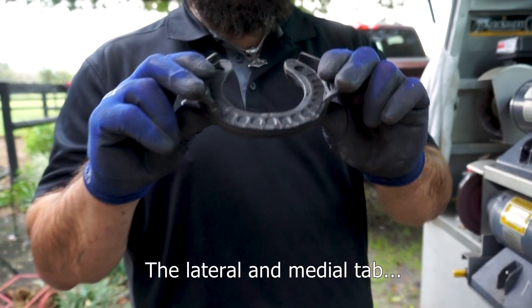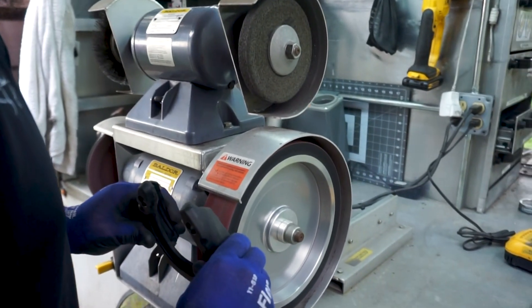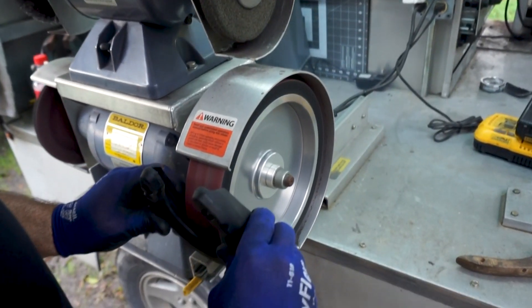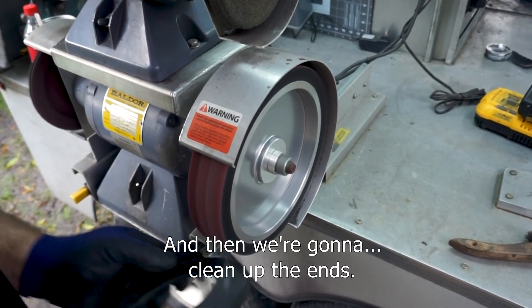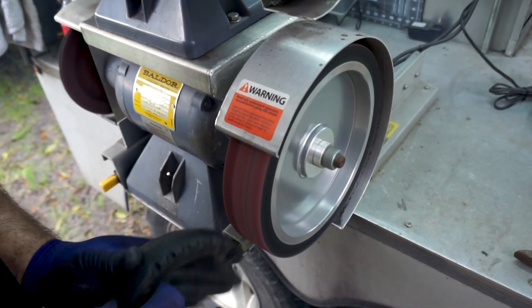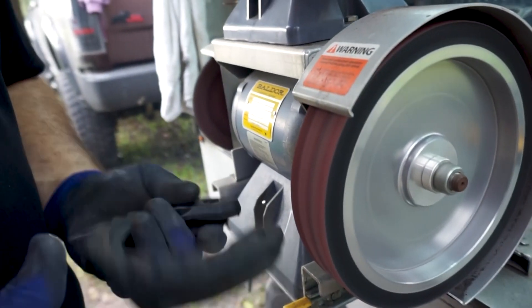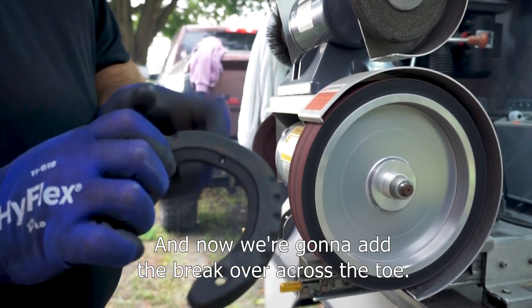Now we're going to bring it to the grinder. We're going to move the lateral and medial tabs out to the sides so we can fit it in, and then we're going to clean up the ends.